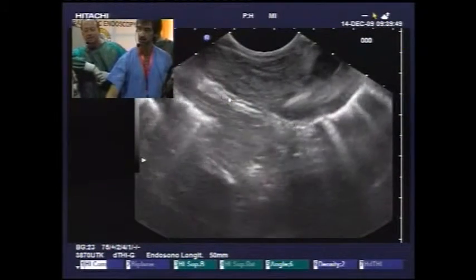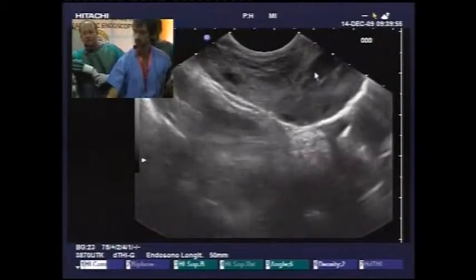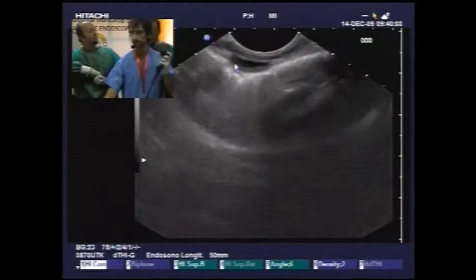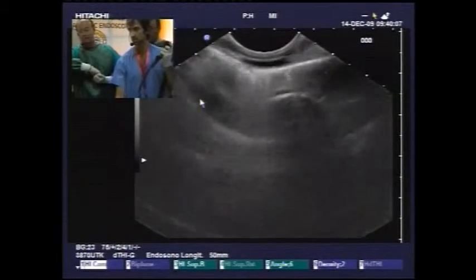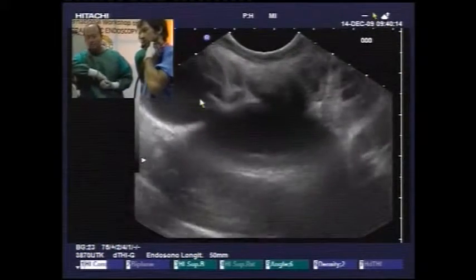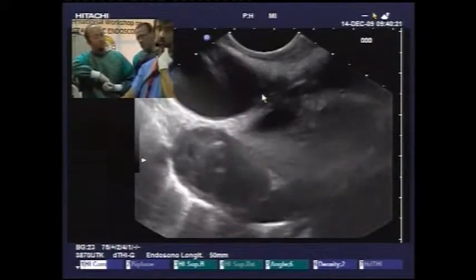And what size nasocystic tube are you going to use? I'll just show you as the tube comes into view, because with the camera position you can't actually get a good view. What size, Naji? Can you see that now? This is 7 French. And I'm going to get it in through. We can, in addition, put a stent, but I don't think that will help too much because of the sphincterotomy.